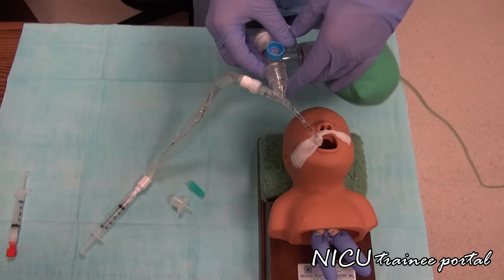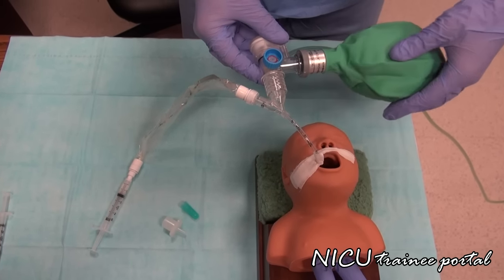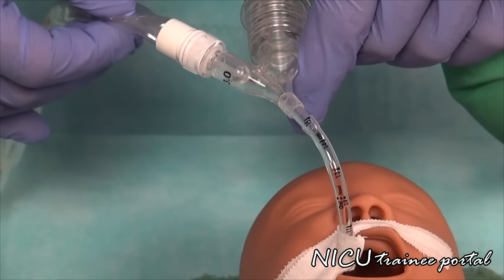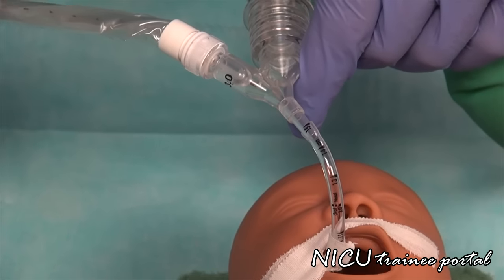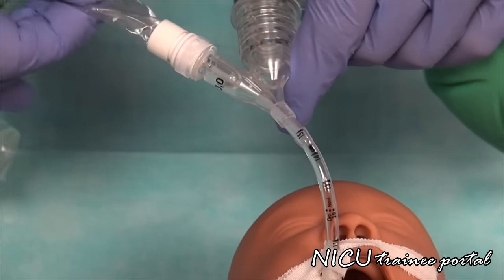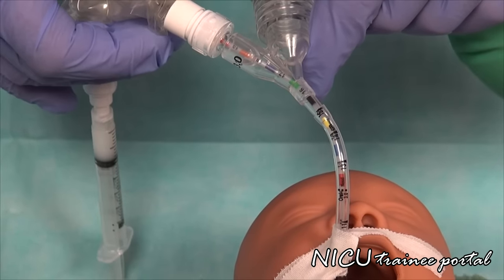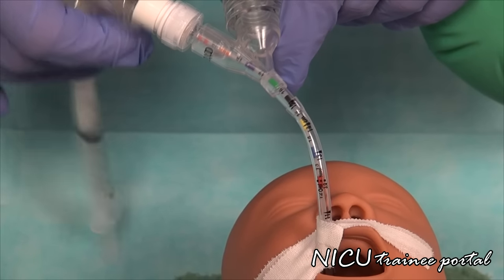For the purpose of the video, I will focus on inserting the catheter. We take the catheter, stabilizing the ET tube, and insert the catheter, matching up the markings on the endotracheal tube to the proper markings on the catheter. I will be matching up the 14 on the endotracheal tube with the 14 on the catheter, which tells me that I am at the end of the endotracheal tube. I will then advance about a half centimeter beyond that, ensuring I am just that distance beyond the endotracheal tube prior to administering the surfactant.